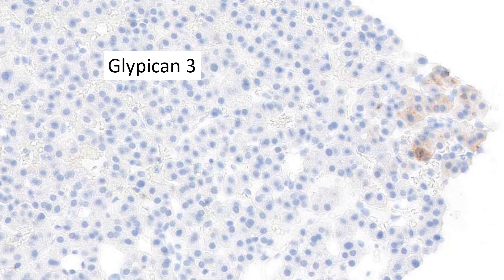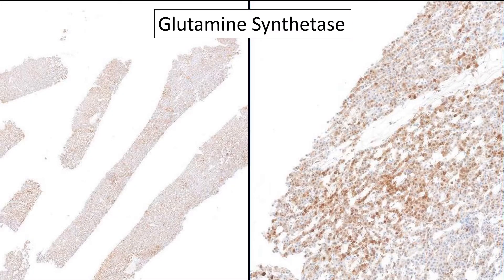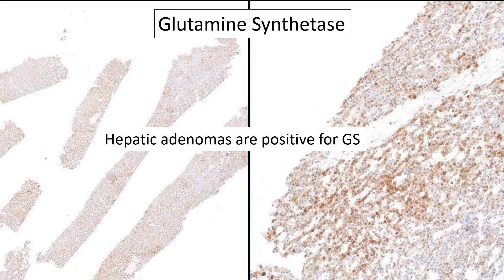The glypican-3 was essentially negative, except for a tiny area — this is negative in my book, no help there. But here's glutamine synthetase: it's diffusely positive. Now that is concerning for HCC, but remember that hepatic adenomas can also be positive for glutamine synthetase. So take that with two pinches of salt.